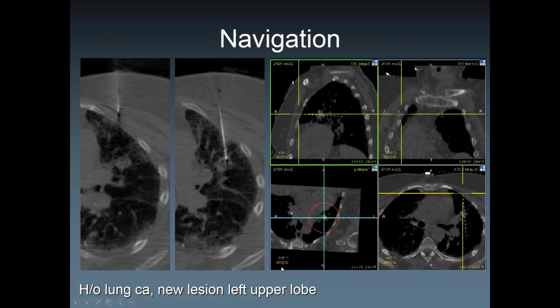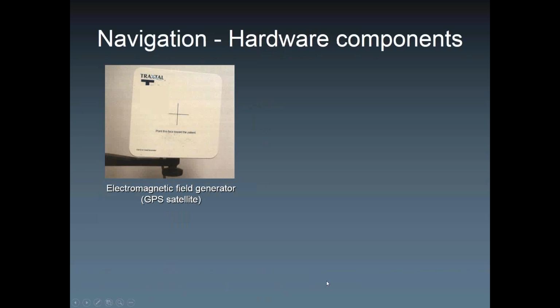Okay. Another device that we've been using in the past is what we call the navigation device. It's tightly attached to the fusion system that we have. We're not using navigation much because it's a lot of effort. So you have, let's say, a funny lesion in there, and the goal is to basically go in real time without scanning, right? So how do you do that? You have to first register the patient. I'm going to show you in a second what that means, and you end up with this kind of funny display. We'll do that in a second.